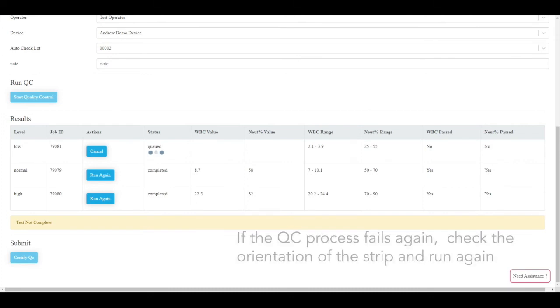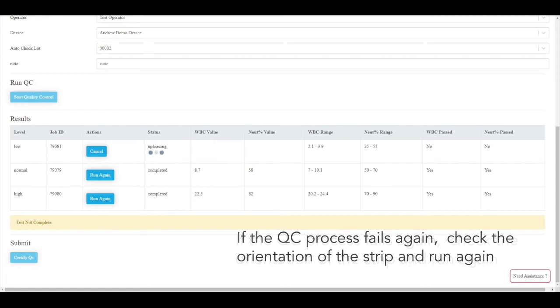If the QC process fails again, or if at any point you receive multiple failures, check the orientation of the test strip and run the QC process again.